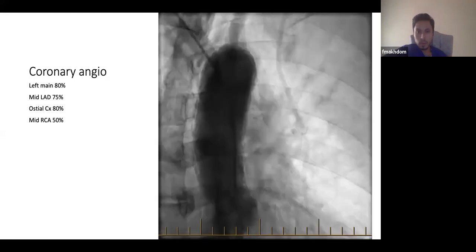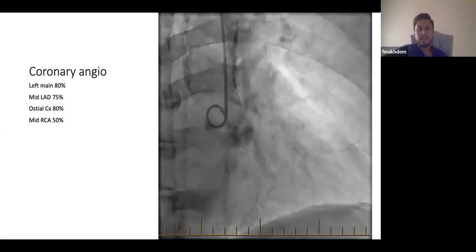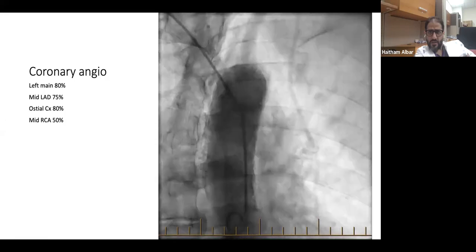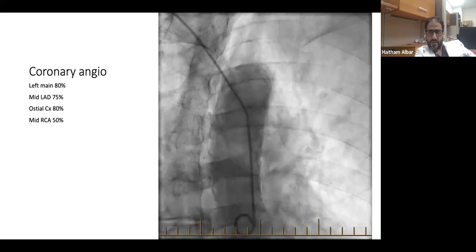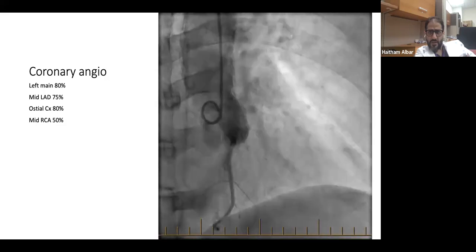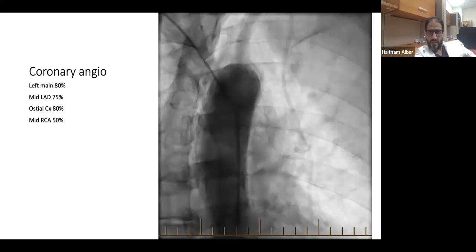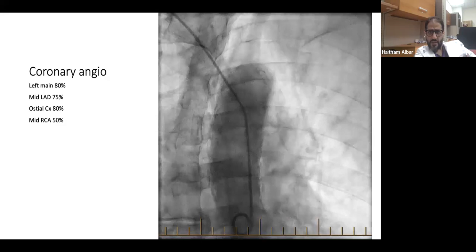So this one is actually an aortogram. What he's doing is taking a shot on the aorta. Then I can see both coronaries coming off. The aortogram is showing a normal-looking, normal size aorta. No sign of dissection or dilatation.